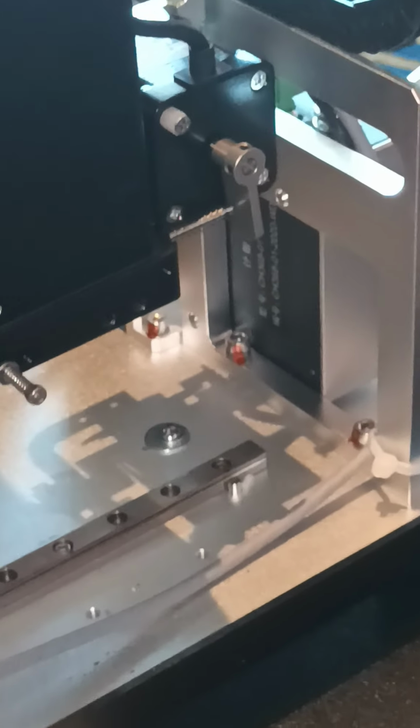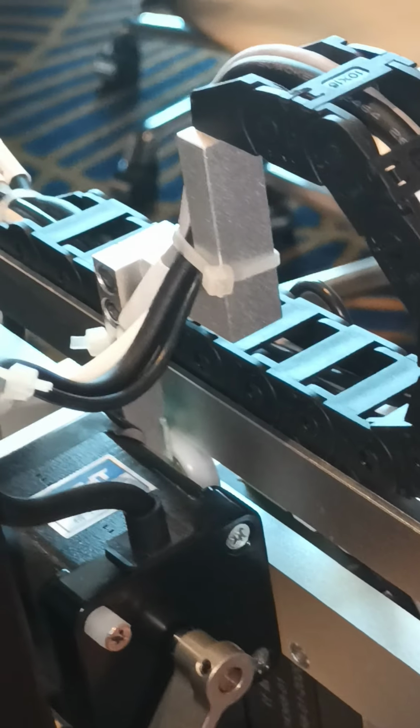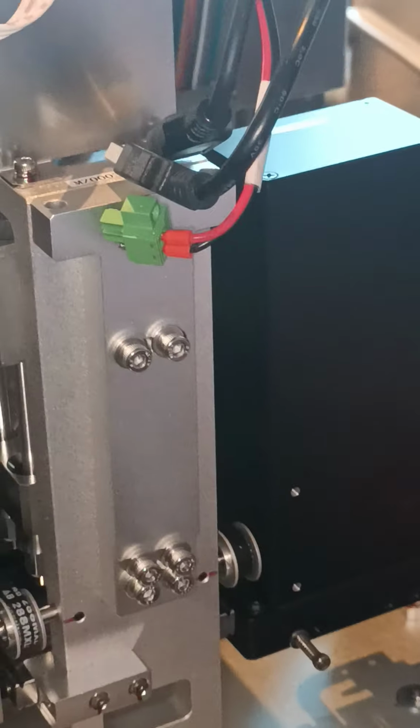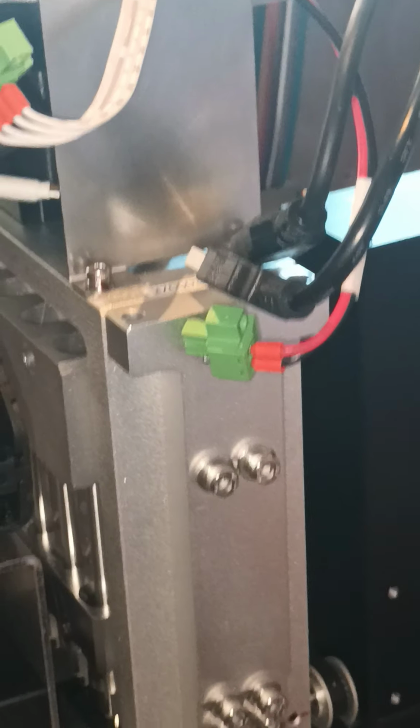You can say this shutter is always off and on, or moving. Basically it disengages like this. And then when it needs to read, boom, read it. It doesn't move continuously. It moves only with this one, then it has to return. That's it. Like close, open. Any damage on this one? Not on this one. Okay. We did this one, right?